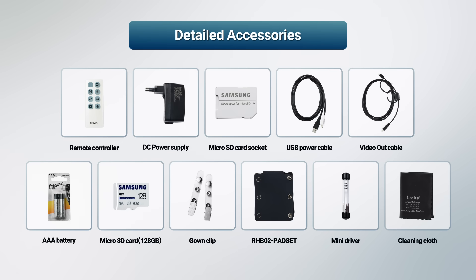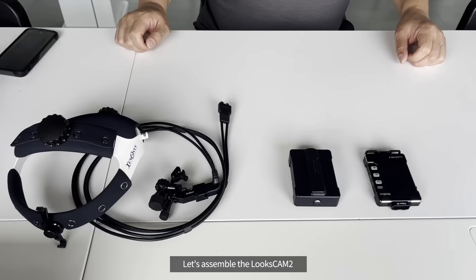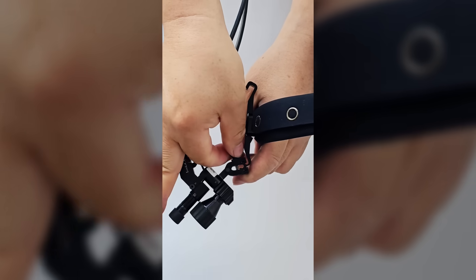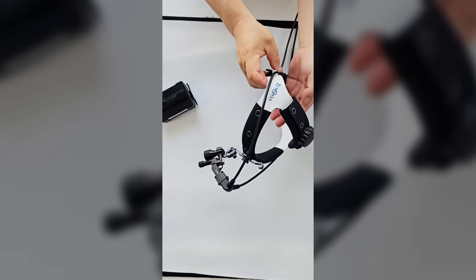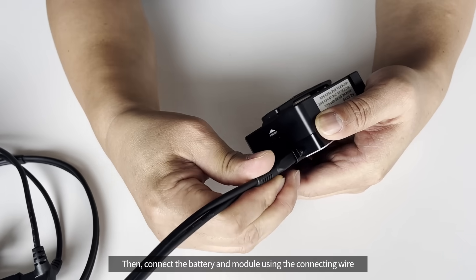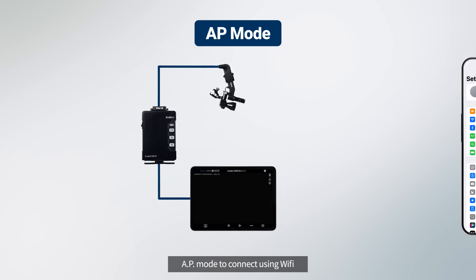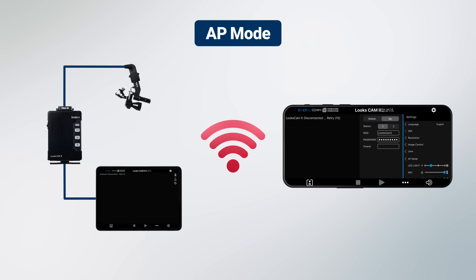In detail, let's assemble the LooksCam II. First, connect the camera module to the headband. Then connect the battery and module using the connecting wire. The product supports AP mode to connect using Wi-Fi, or station mode which uses a router to connect.